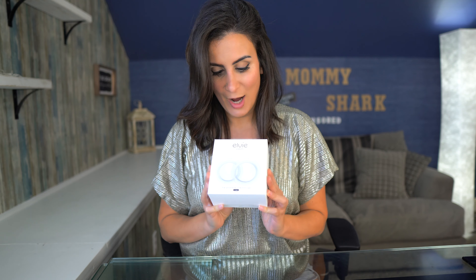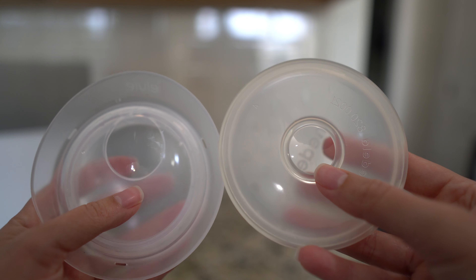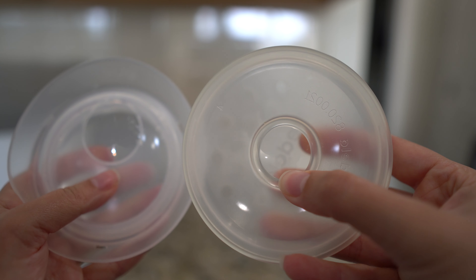Let's go ahead and open this awesome new product. As you open the box, you see that there are two of them, and just looking at them, you'll see how different they are from the Medela Soft Shells. The first thing to note is that the hole on the Elvie Catch is a lot higher and all the way to the top, compared to the hole on the Medela Soft Shells. You might be wondering why that is — it's because these two products are made for two different purposes.